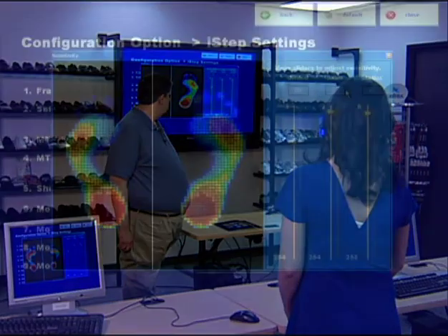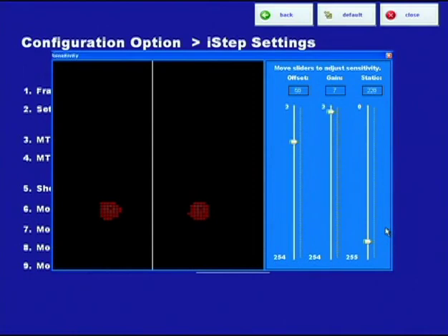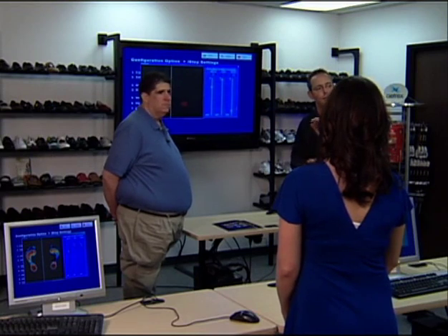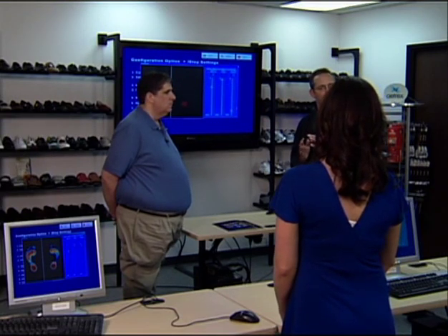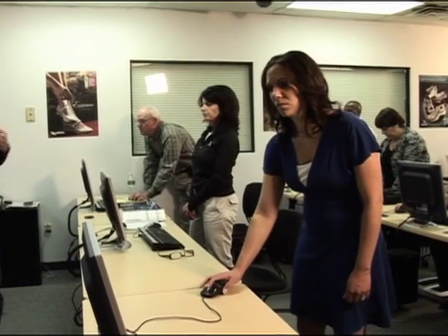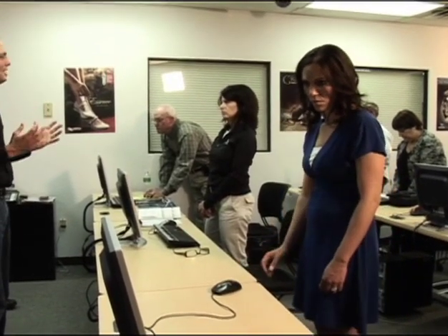If I raise static reduction too much, it takes too much pressure — it reduces everything. You can see there's no foot left anymore. So we don't want to make static reduction too much. We want it close to zero, but enough to eliminate the little annoyances that could impact the accuracy of the test. Think about it as how much pressure is needed to awaken a sensor — to have a sensor jump in and be part of the test.